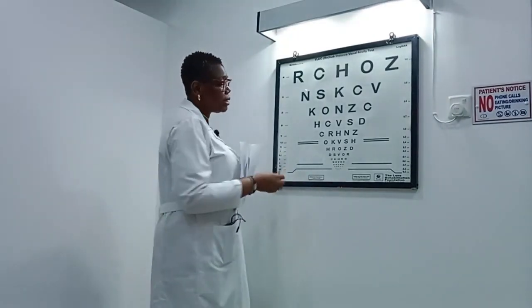be able to carry her distance task comfortably without bumping into things, to be able to read her charts, to be able to read signages as she's going out and all that. So for us to be able to get her distance device prescription, we're going to take it from what she has as her VA, the actual over the desired.